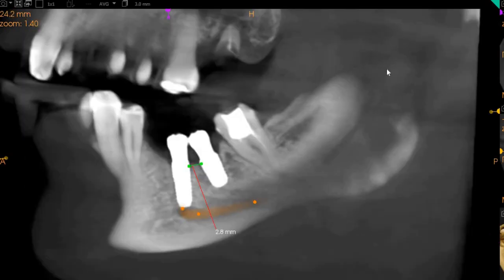Customized abutments can be fabricated by the lab if impression taking at the implant level or the bone level is difficult. So we will advise that the abutments need to be trimmed interdentally between the implants, so that a proper implant impression can be taken.